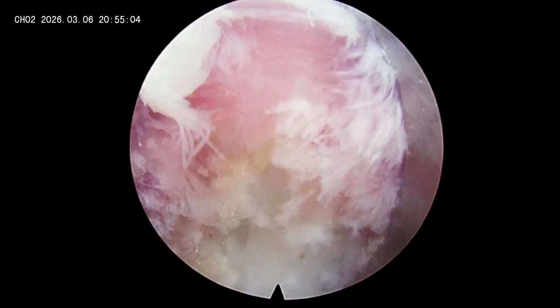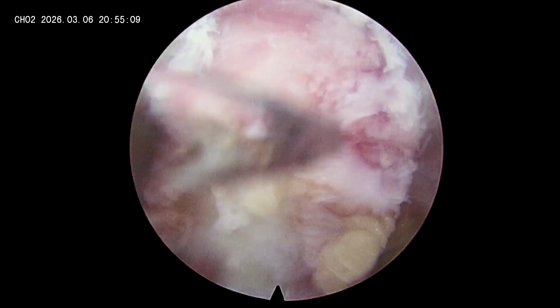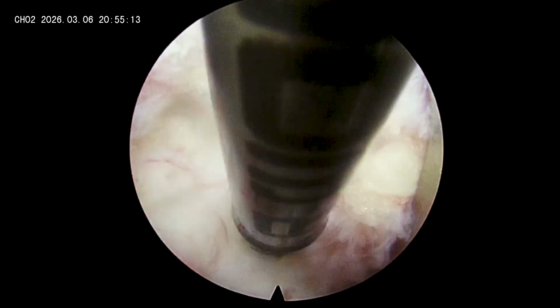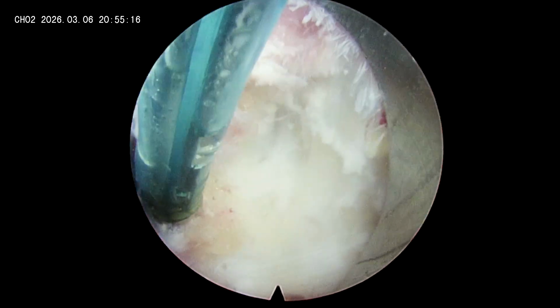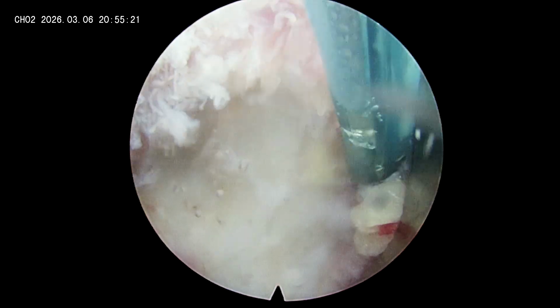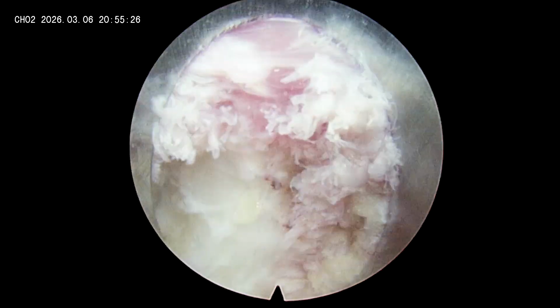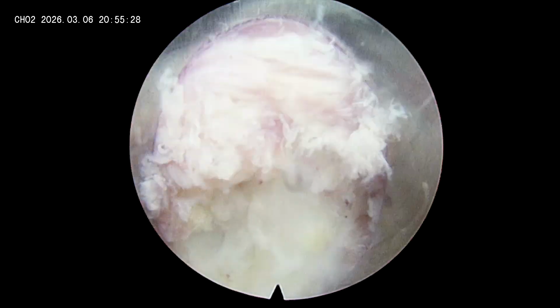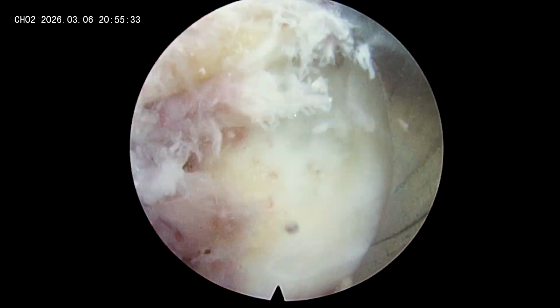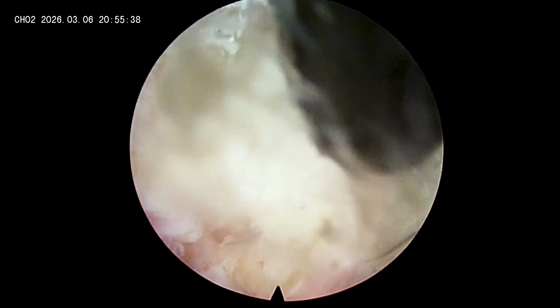Here identification of some landmarks is very important. In this case we are going to identify the medial border of the inferior articular process, then the superior border of the inferior lamina and the inferior border of the superior lamina. As I am standing on the right side of the patient, 3 o'clock is cranial, 9 o'clock is caudal, 6 o'clock is lateral, and 12 o'clock is the medial side. This is the orientation of this surgery.